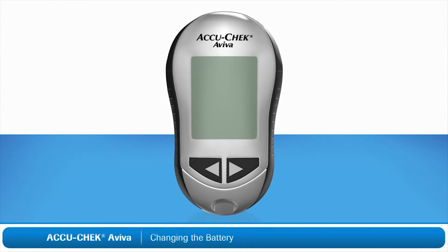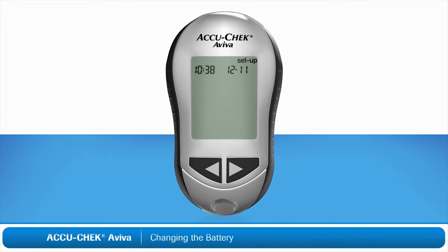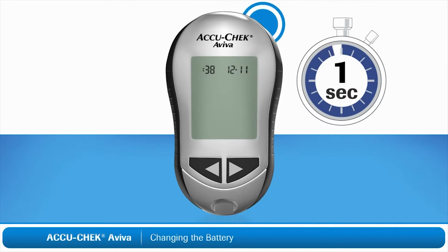Right after you change the battery, press the on-off button. The meter will beep. Setup and the hour are flashing on the display. Your meter will prompt you to confirm the meter's time and date settings. If the time and date are correct, press and hold the on-off button for about 4 seconds, then release the button.